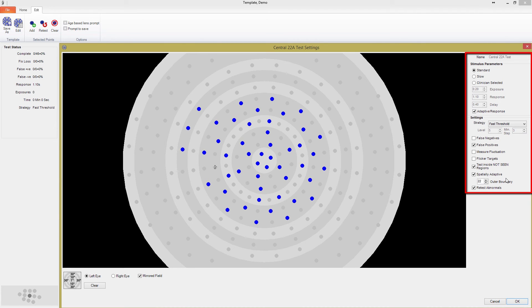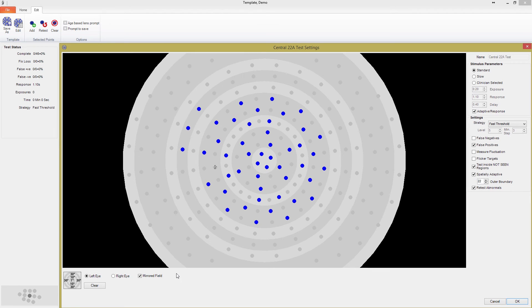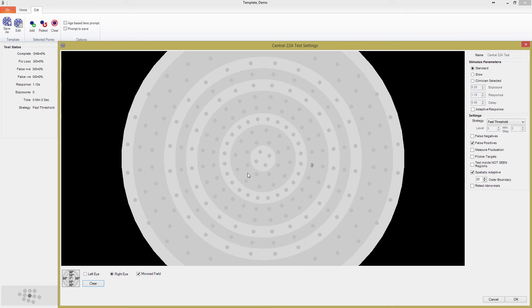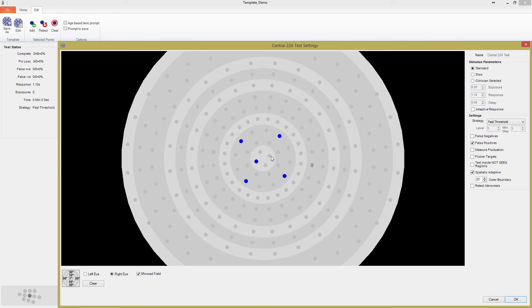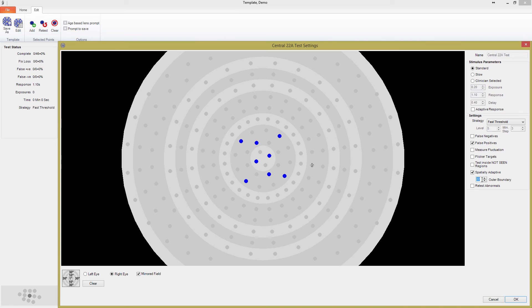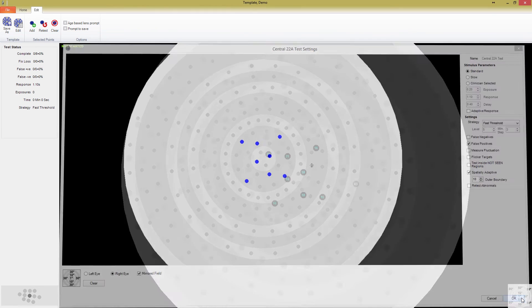I'll demonstrate the creation of a template now. First, I'm going to clear out all the existing points by pressing Clear. Let's build a macular test. I'm going to select 8 points in a central 10 degrees. This may be a little more sparse than you want to use in practice, but it will suffice for the demonstration. The feature I want to demonstrate is Spatially Adaptive, so I'll make sure that is ticked. Since this is a macular test, we don't want the field extending out past 10 degrees, so I'm going to set the outer boundary to 10 and press OK.